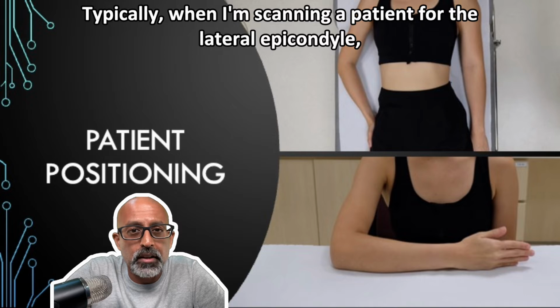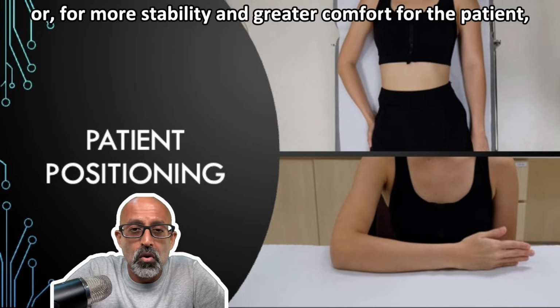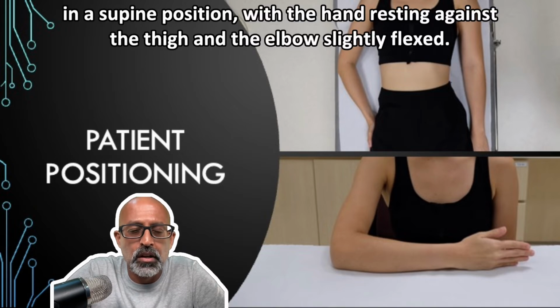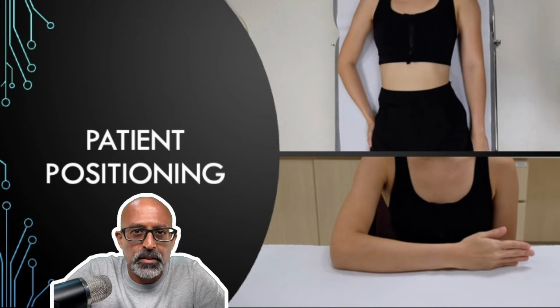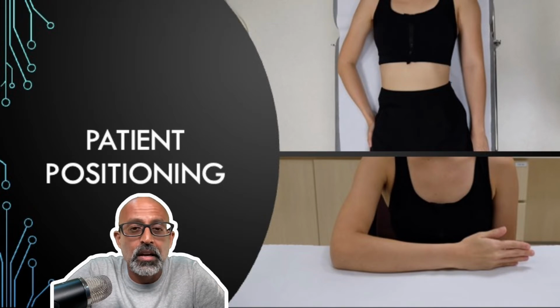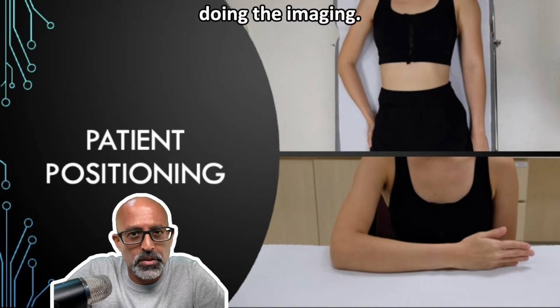Typically, when I'm scanning a patient for the lateral epicondyle, I'll either have them sitting down with their elbow resting on the examination couch, or for more stability and greater comfort for the patient, I may have them lying in a supine position with the hand resting against their thigh and the elbow slightly flexed. This exposes the lateral aspect of the elbow really nicely and also is more comfortable for the patient, and there's also more stability for you when you're doing the imaging.